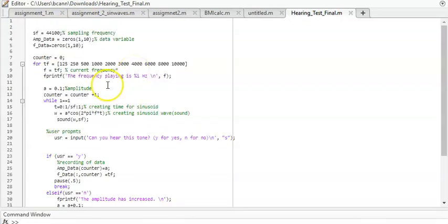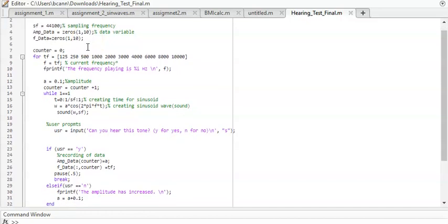Hi, I'm Soyoka, and I'll be explaining the code on how it works to test the user's ability to hear certain frequencies at amplitudes. So first we have the sample frequency, which is CD quality. Then we have the two data tables for the amplitude and frequency when we record the data to later present on a table. The counter is to implement the next row for inputting the data.